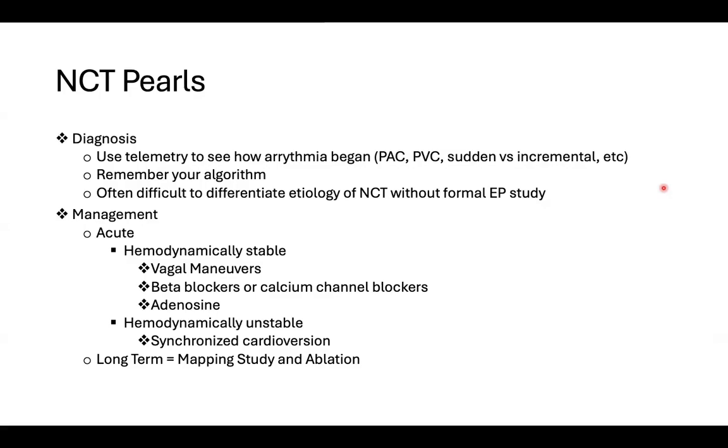Yeah, just that sudden versus incremental at the top. A gradual increase in heart rate traditionally is more of a sinus tachycardia, whereas if you see those sudden jumps in the heart rate graphs, it would usually be one of these SVTs that we've talked about. And I agree with you completely, Emily. It's hard for you to say, oh, the RP interval was 40 milliseconds versus 60 milliseconds, so I know what it is. Unfortunately, that's not the case, but especially when the SVT is slower than 150, 160, it can be very helpful in figuring out what it is.